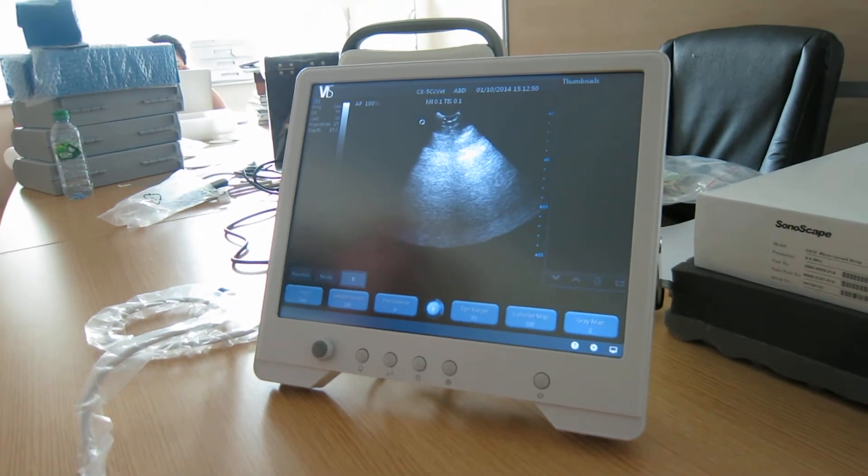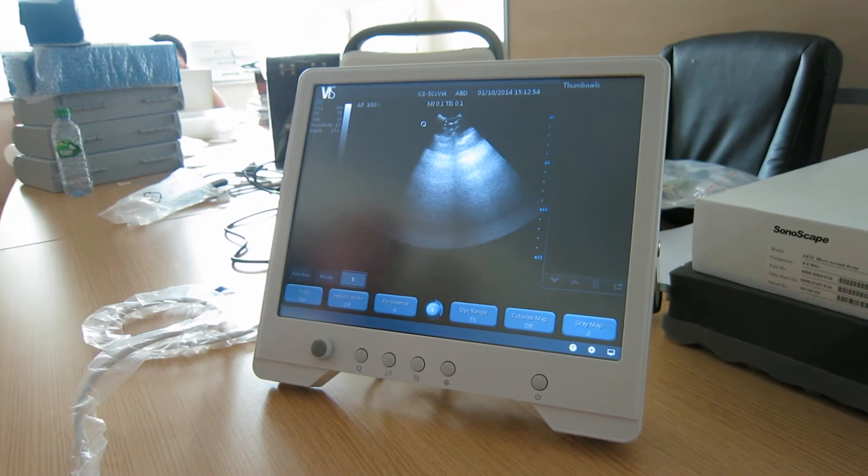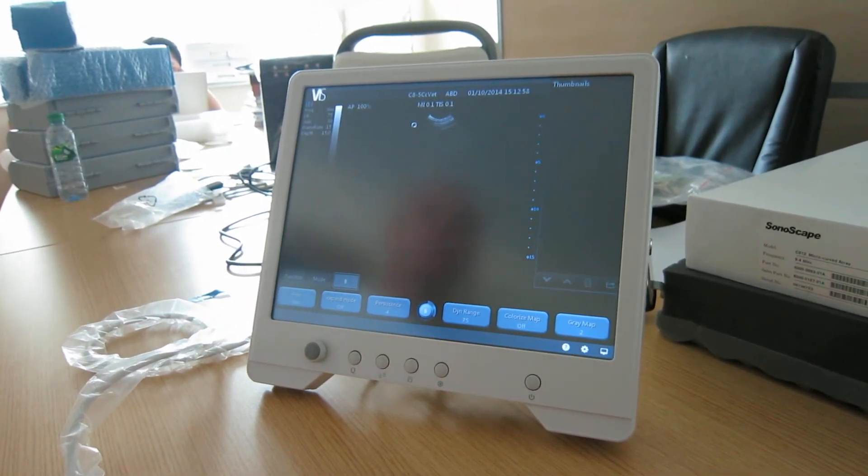Some of the configurational options on the VIS ScanPad. For today's demonstration I'm just going to be using my liver as a subject.